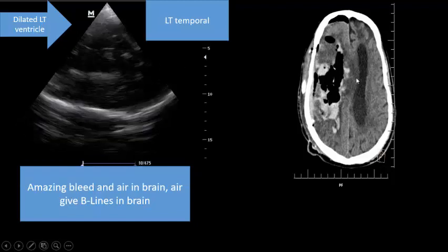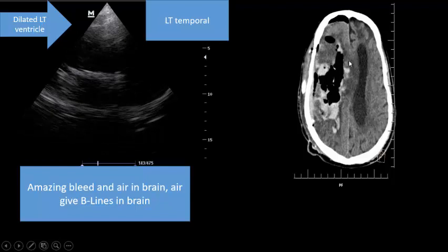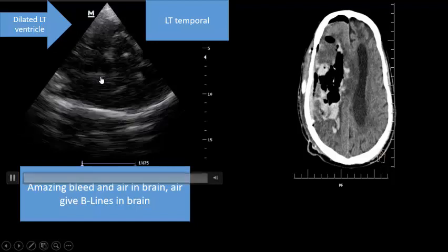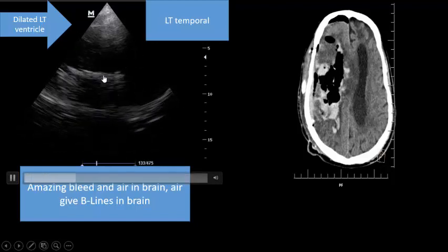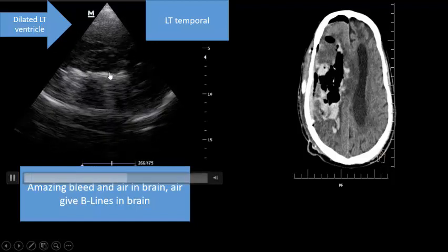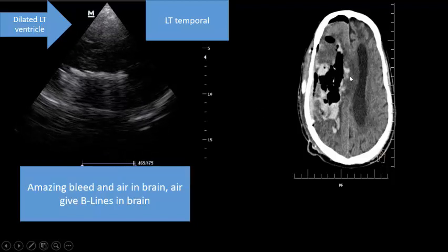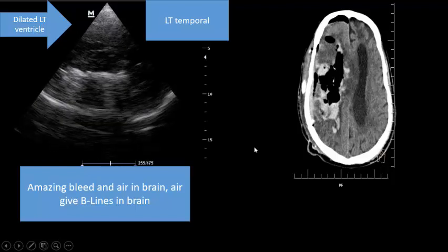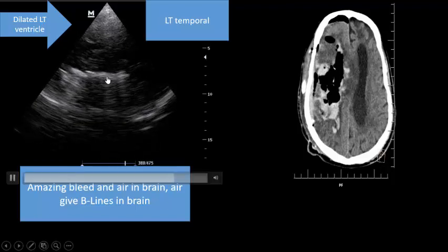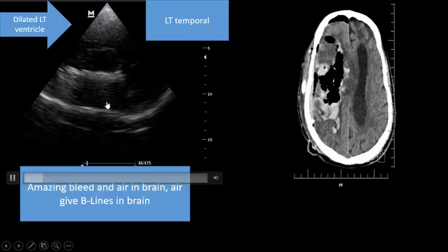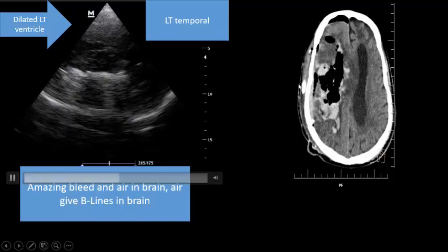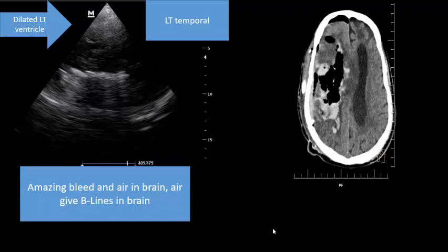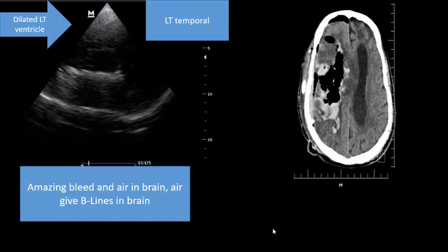There is a dilated lateral ventricle here on the left side, and amazingly there's a hyper-echoic area with B-lines. To differentiate between air and blood in the brain: air will reveal a B-line, as you can see — this is air and this is a B-line. Hemorrhage will not show a B-line.